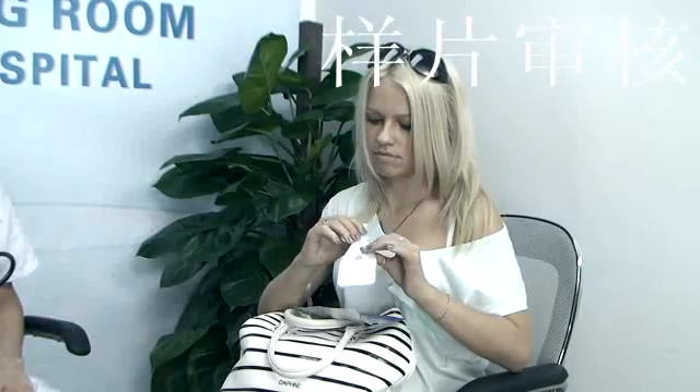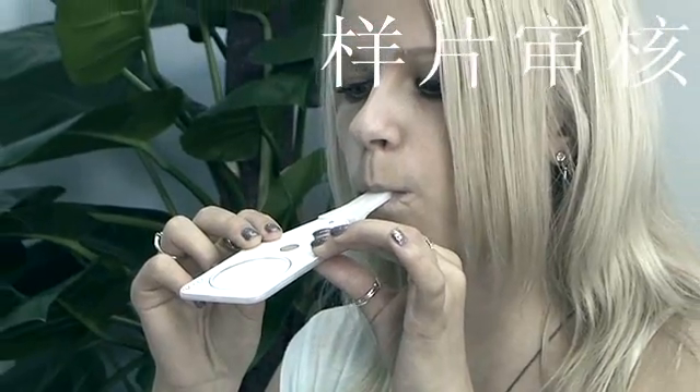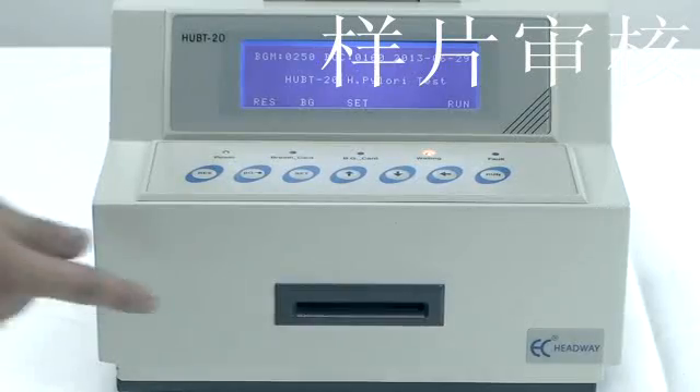The subject blows into the collection card through the mouthpiece with proper strength, trying to make the air blowing last as long as possible. The subject can exchange breath but cannot inhale from the mouthpiece. Keep blowing for 3 minutes.